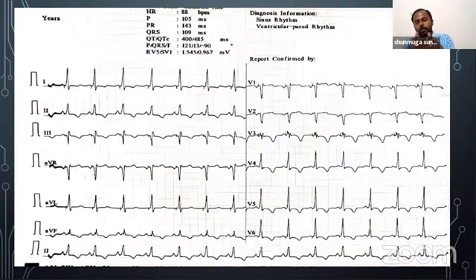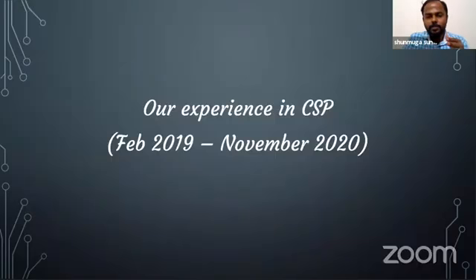So what I thought was maybe I could have produced some spasm in the septal coronary arteries. That would have produced an intense vasospasm and a STEMI, or there may be embolization of either a thrombus or air into the coronary circulation. So these things can happen while doing the pacing. So you have to be very particular in keeping the lead in the subendocardium. Your lead should not cross into the left ventricular cavity. You have to keep everything in the left ventricular subendocardial area.